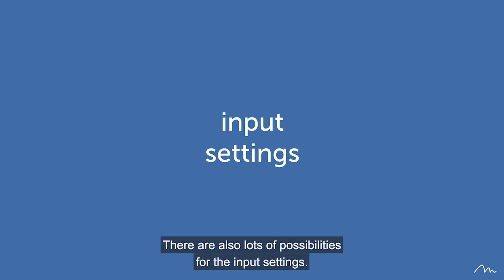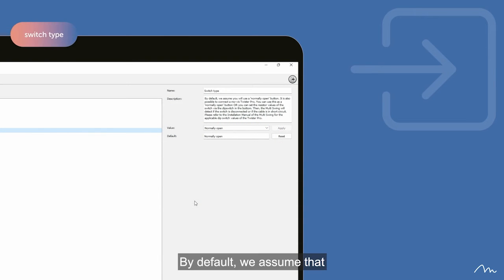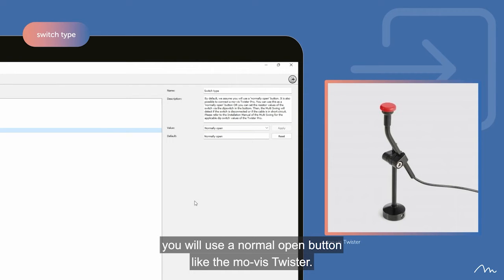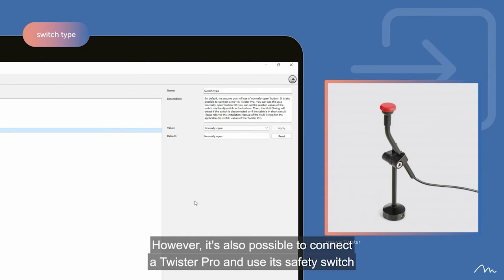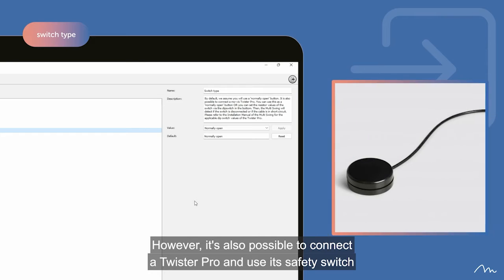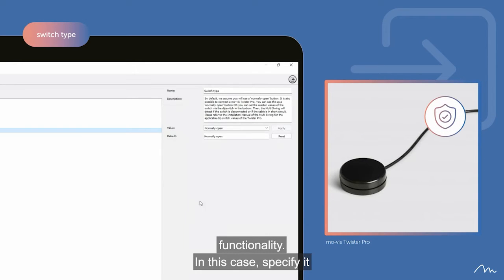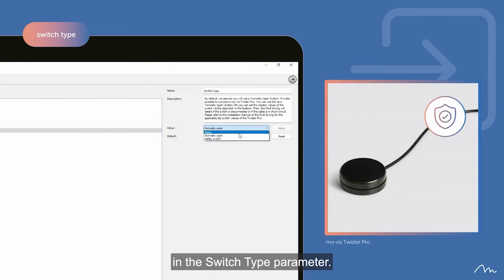There are also lots of possibilities for the input settings. By default, we assume that you will use a normal open button, like the mo-vis twister. However, it's also possible to connect a Twister Pro and use its safety switch functionality. In this case, specify it in the switch type parameter.